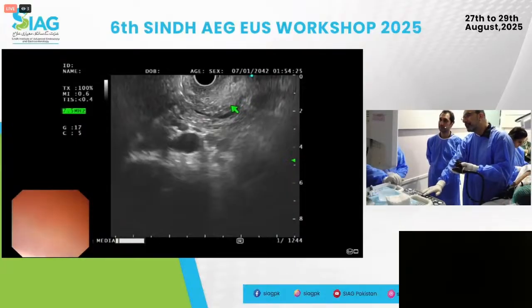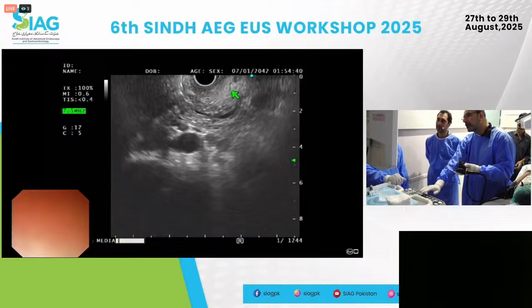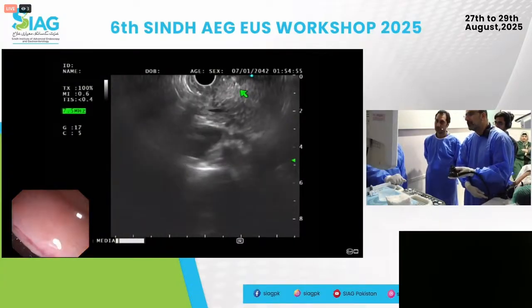So if I can follow the duct from the major up here, this is your portal vein. Around the portal vein, that tells me that this is not divisum. In the setting of divisum, what will happen is the duct will stop around somewhere here, and as I go clockwise, I will see the minor dorsal duct up here, and it will go up this way because it will be in the dorsal part of the pancreas. So that's one way, as Dr. Sadhna said, to look for divisum.